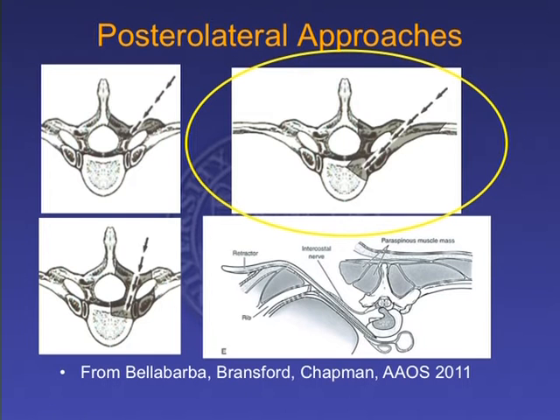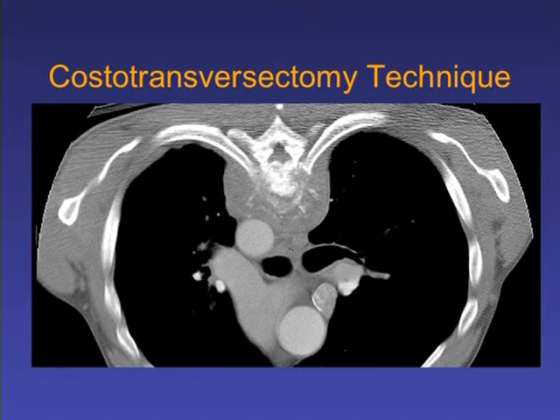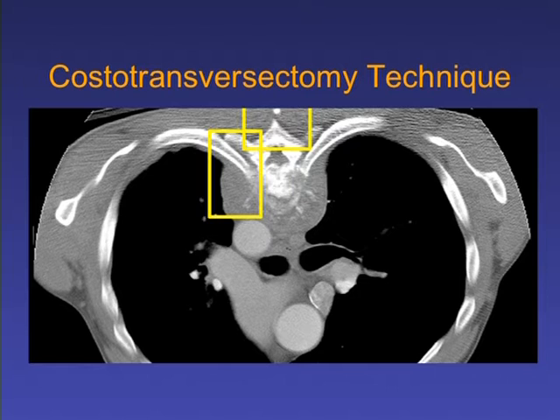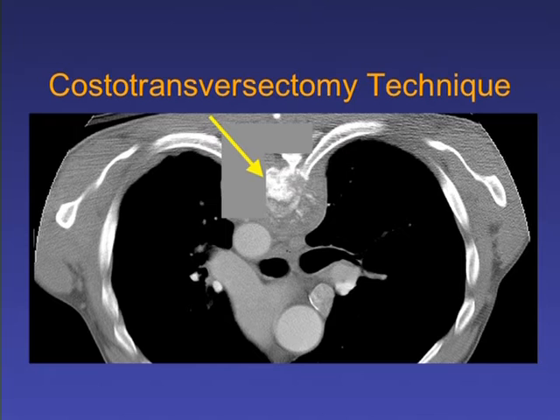And what I'm going to focus on really is the more classic costotransversectomy. I'd say it's the workhorse for the type of procedures we're discussing and the one that's most commonly used. And here's just an example of what we try and achieve. As you can see, this is a transverse cut at the level of the thoracic spine. We basically resect the lamina, transverse process, pedicle, part of the rib several centimeters out, and ultimately gain access to the anterior spinal canal, the anterolateral aspect of the vertebral body, and can perform the resection. This can be done either unilaterally or bilaterally as needed, and ultimately can also result in a reconstruction.